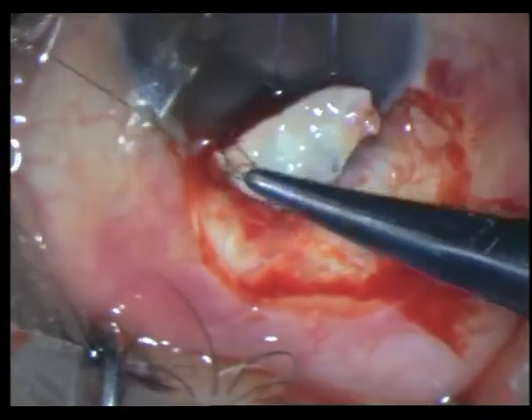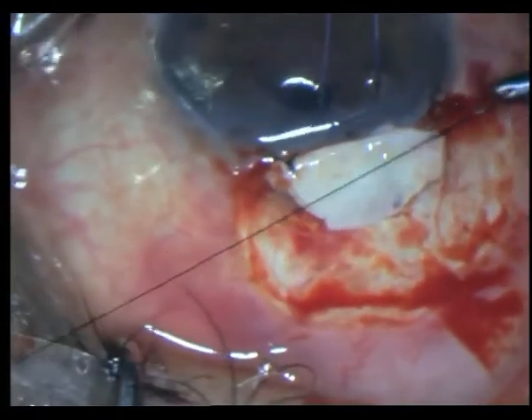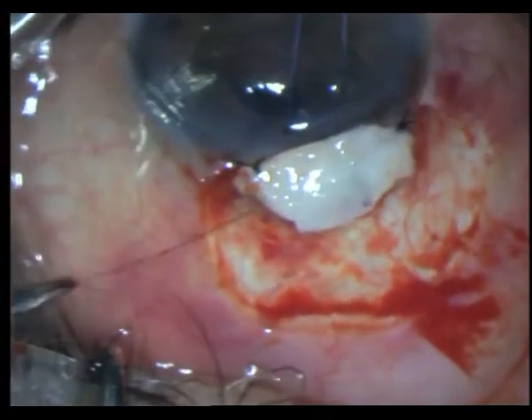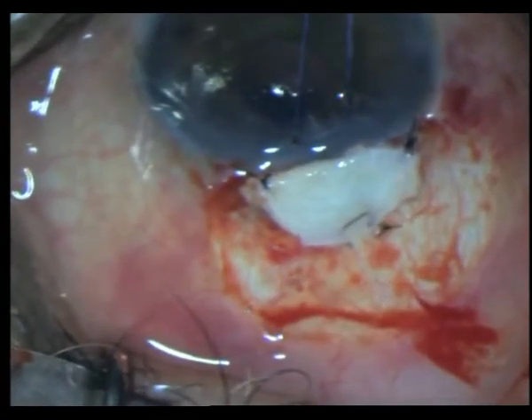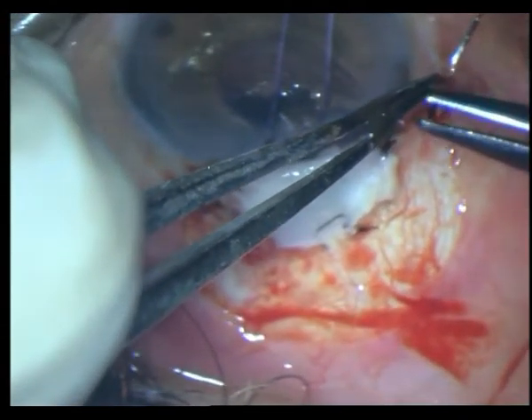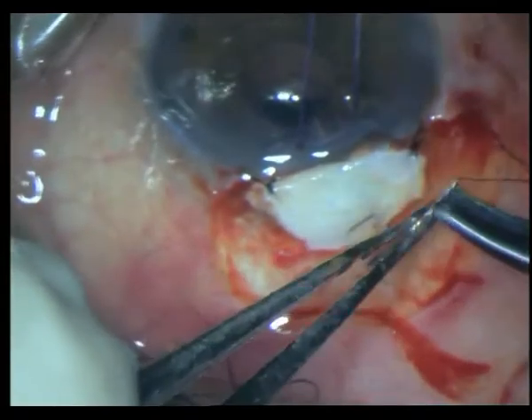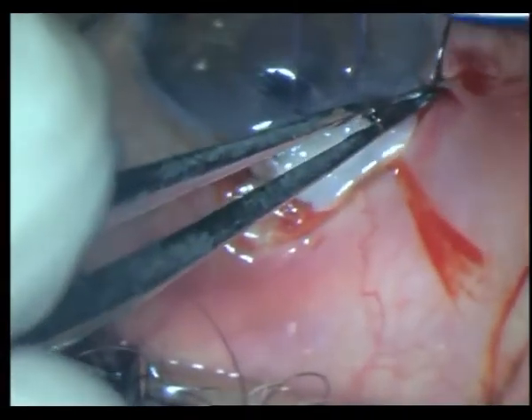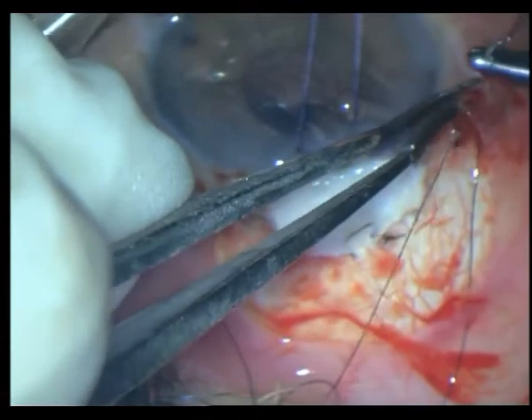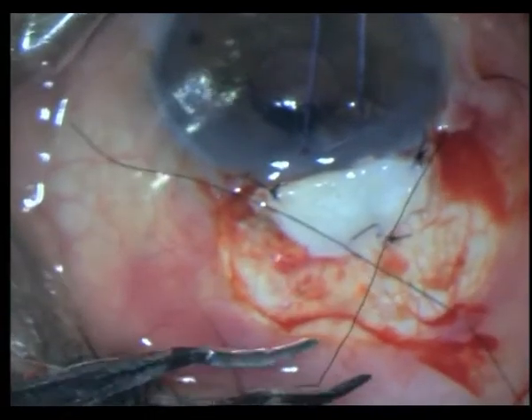I am using non-absorbable sutures to secure this scleral flap onto that leaking area. I have put two base sutures and a mattress suture behind, hoping that between the mattress suture and the base suture the bleb will continue to function. Just closing up the conjunctiva with the same non-absorbable sutures — I will remove them later.